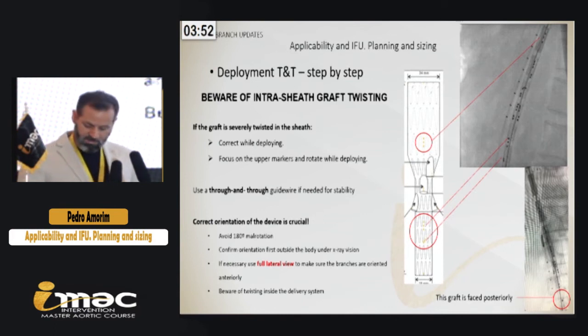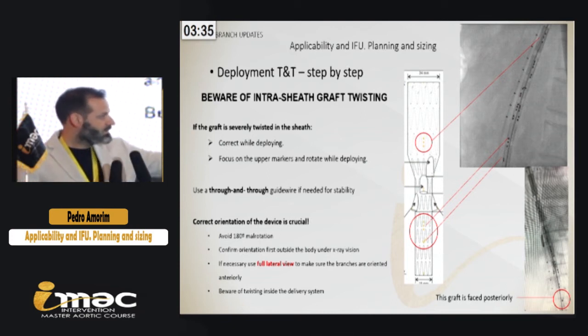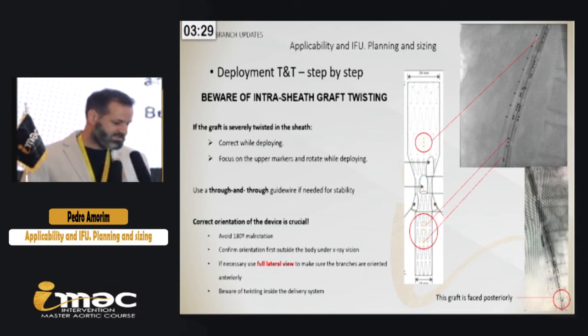Okay. If necessary to have confidence in the deployment, we should do a full lateral view. We must avoid the 180 malrotation. That would be a catastrophe. In the right corner below, we have this, emphasizing the thick marker that shows us that this graft is faced posteriorly.